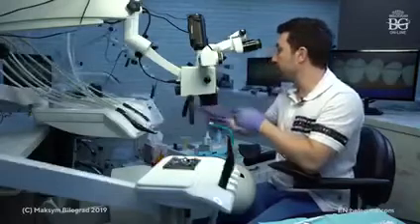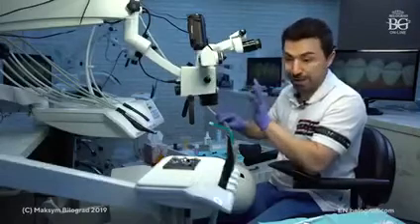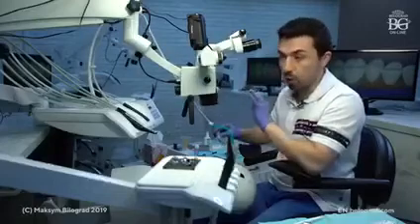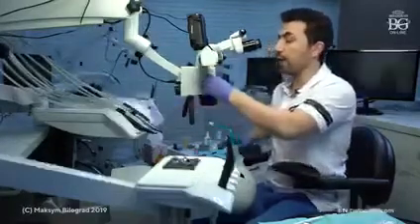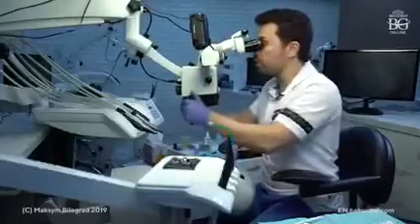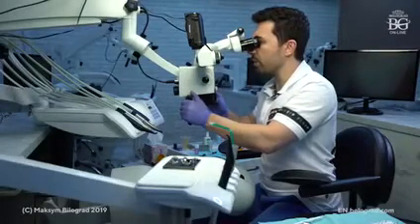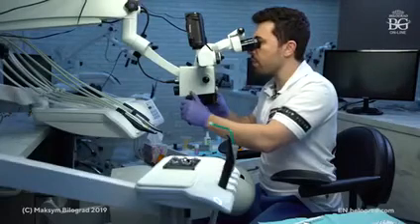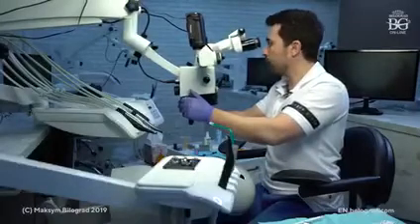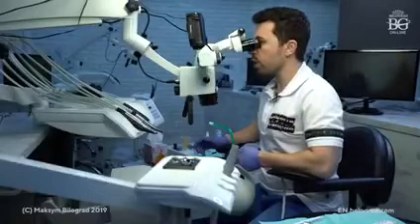Okay, we put speed 2000 on the electric motor. With your increasing handpiece it will give you 10,000. So basically now we work with 10,000 RPM, no water, and we will work with pretty high magnification. Okay, working with no water, there is a sort of risk of overheating, but with that type of speed, which is 10,000 RPM only, it's not a big problem for the pulp. And also what is important, our assistant helps us with air spray. So the assistant works with air spray all the time you prep.